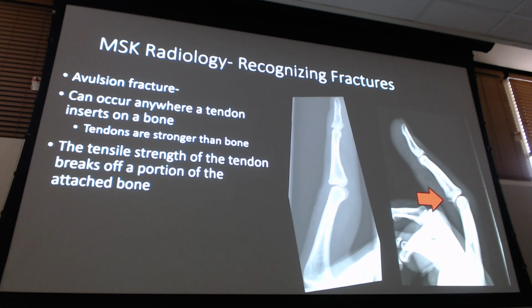And so if I follow my cortex down, got that little line, got some bone there. So that's where I see the fracture, right here. Follow my cortex around, and there it is. Now, I'm not gonna stop there, I'll do the entire thing, but here's my normal. And that's what an avulsion fracture is. Any area where it kind of got ripped off. Another way to tell an avulsion fracture from just a regular clean fracture is it looks like a puzzle piece, right? If I were to take this and put it right back in there, it's gonna fit perfect because it was just torn. It looks like it was just torn right off the bone.